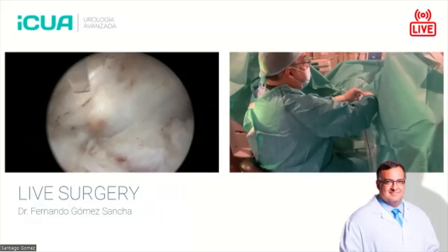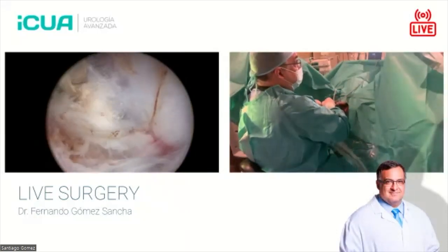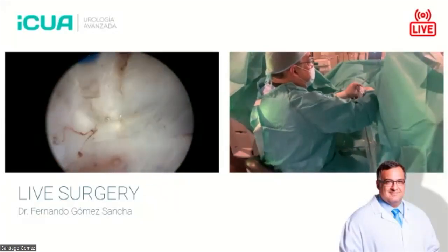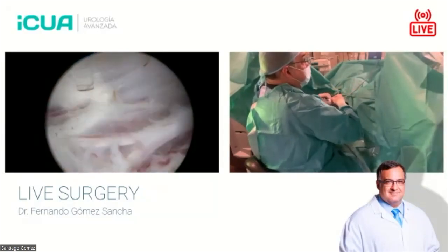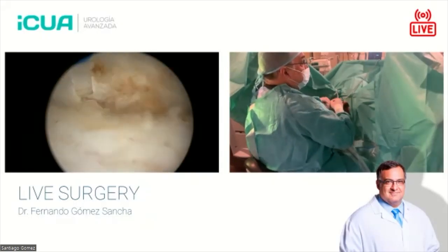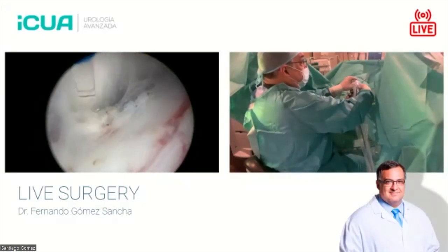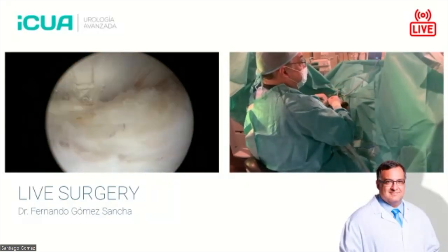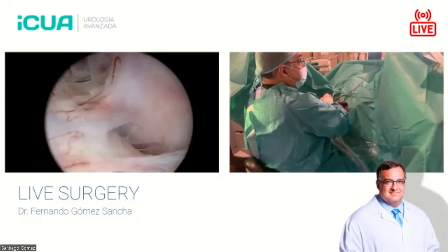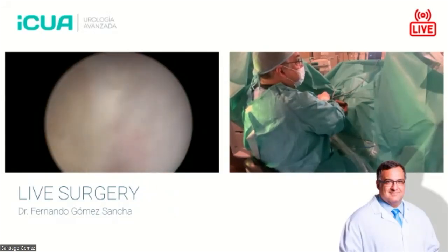I teach a lot of people, and once they get familiar with this concept, they become aware that the way you handle the laser fiber matters, not only the settings. If you think the settings are going to define the tissue effect, you will not understand what's going on. You will say, why did I perforate here? Why did I cut too deep? Of course, your working distance was not correct. You got too close to the tissue, and the energy was too disruptive. You have to reflect on these things in order to understand, and in order to do a nice and safe operation.